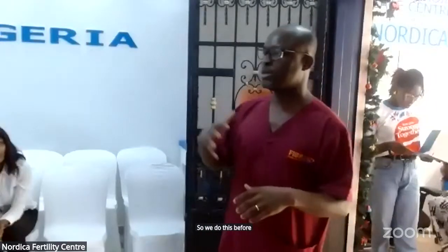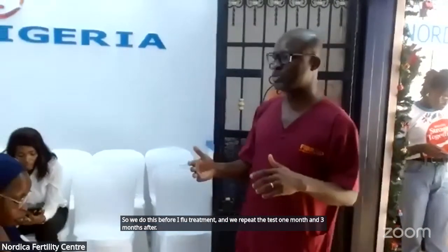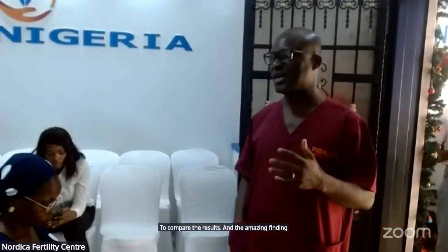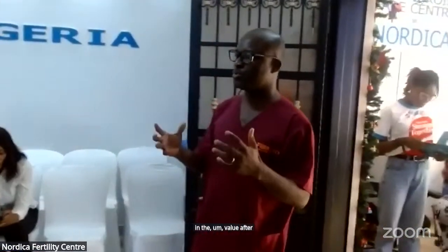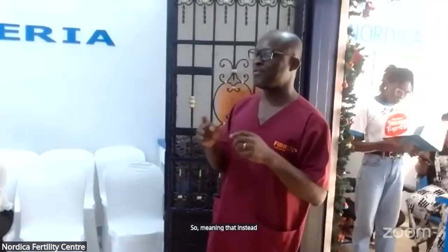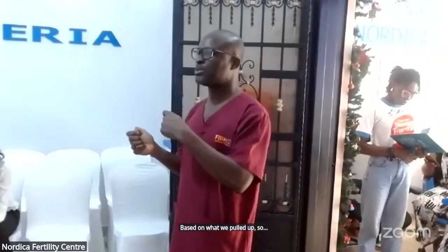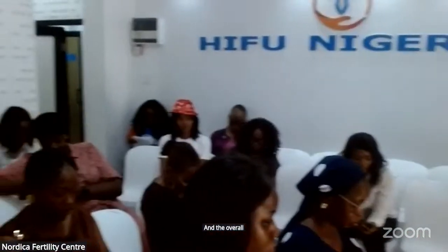We do this before HIFU treatment and repeat the test 1 month and 3 months after the treatment to compare the results. The amazing finding is that there is a relative increase in the value after HIFU treatment for the people that we treated so far. So instead of having a negative impact, as people would have thought, it has a positive impact on the ovarian results at the end of the day. So it does not affect the eggs.